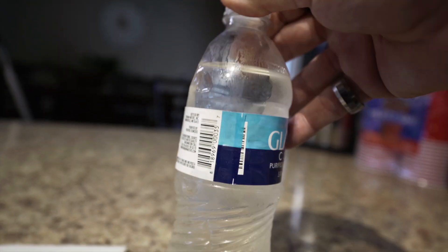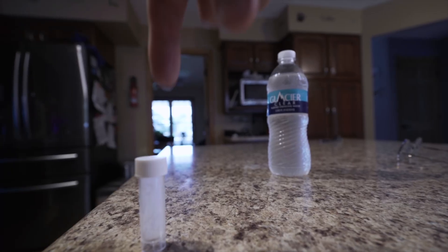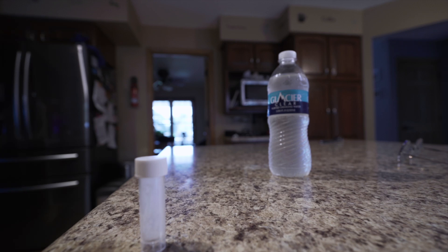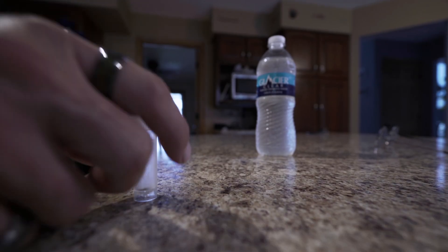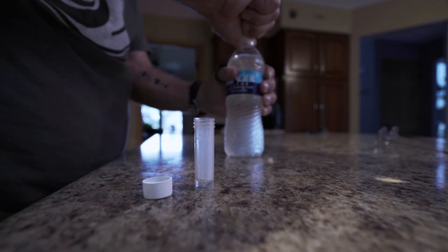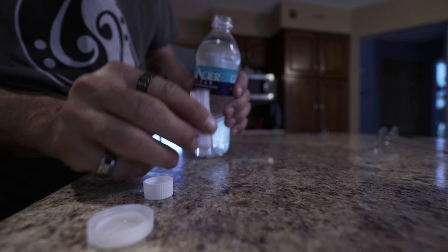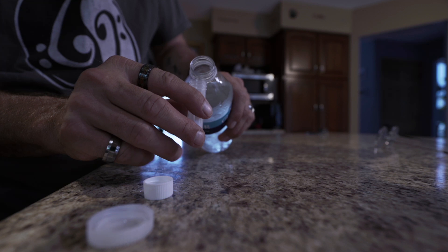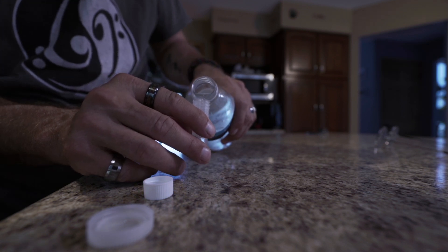The first test we're going to do is fill up this vial — the one with the powder in it — about three-quarters of the way full. This tests for bacteria in the water. If the water turns purple, there's no bacteria; if it turns yellow, there's significant bacteria.